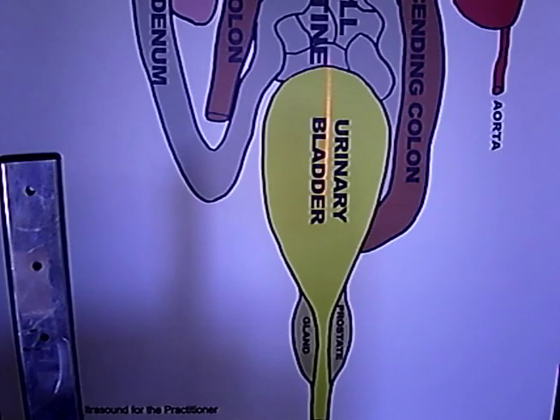Once the urinary bladder has been located in a ventral midline sagittal position, use the transducer to fan the ultrasound beam to the patient's right side, then reverse and fan to the patient's left side until the bladder is no longer seen. In some cases, it is necessary to slide caudally and repeat the process to see the entire bladder.